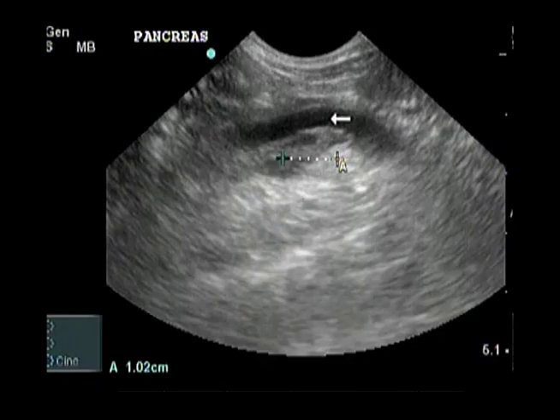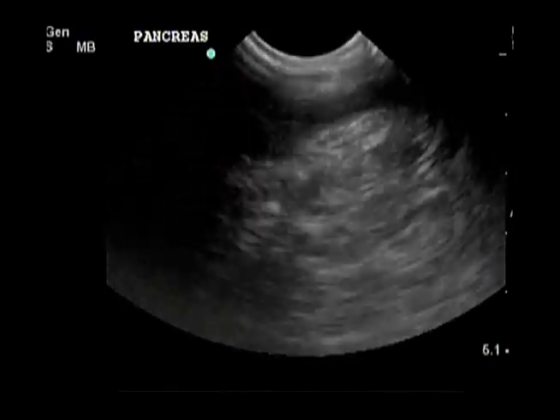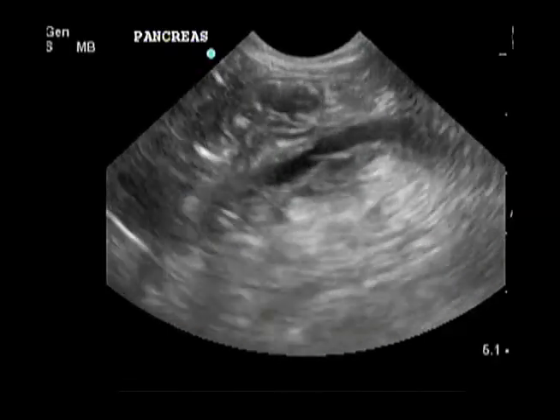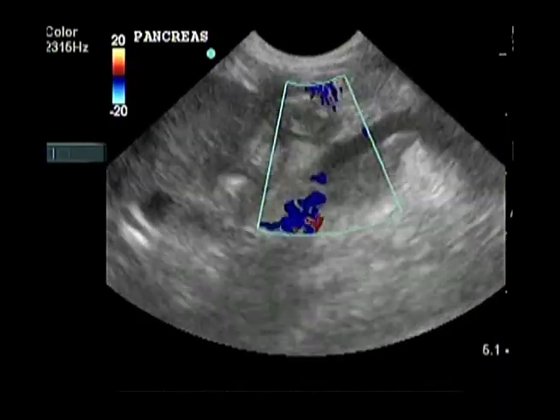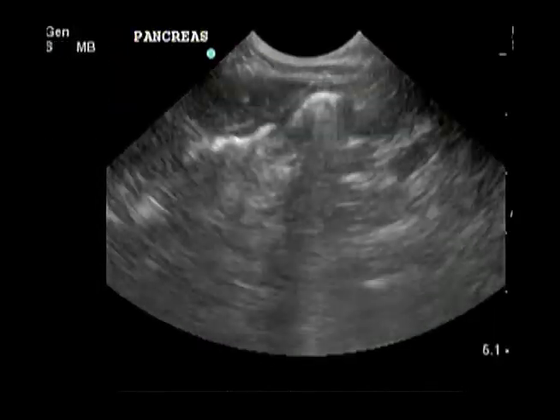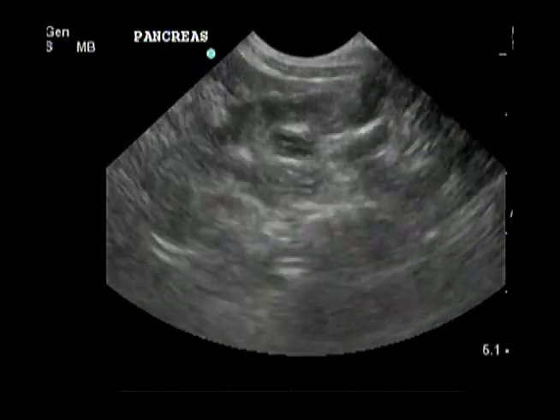The stomach and pancreas are connected to each other, and it makes sense that any disease process that affects one organ will affect the other. The same can be said for the duodenum, major duodenal papilla, common bile duct, and pancreatic duct. The purpose of this DVD is to help you find and recognize these major organs and some lesions associated with them. Transducer positions and movements will be described as presented in the Tips and Techniques DVD.